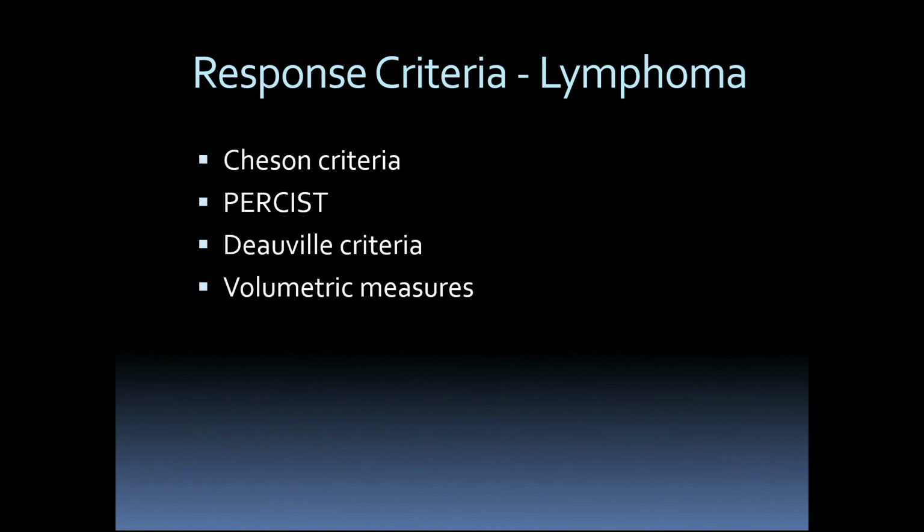And I'd be interested to hear whether you find that in your clinical practice you're getting requested to give them a numerical value. I certainly am.